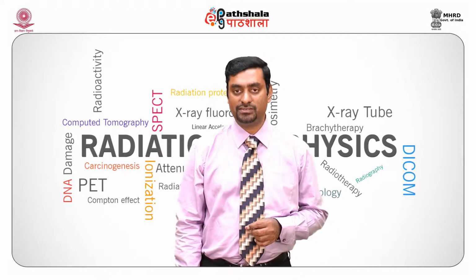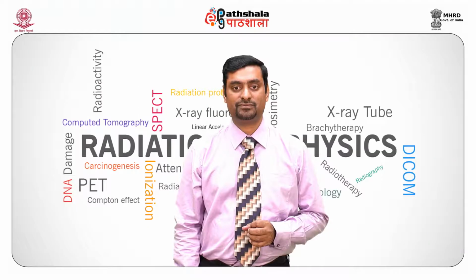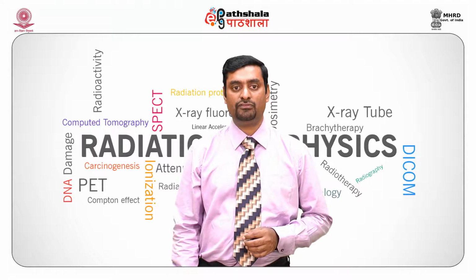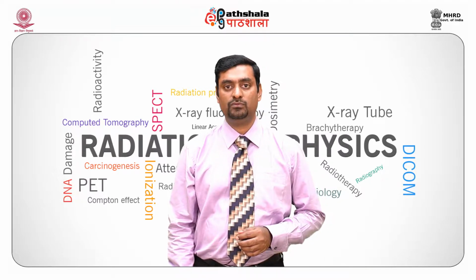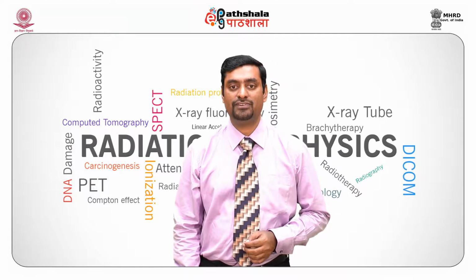100 microns in size. Here we see an image where there are a lot of small dots which are visualized. There are about 5 pairs of dots in that image. However, some are not visualized. The best quality mammography system would show up all the patterns that are seen in this phantom.